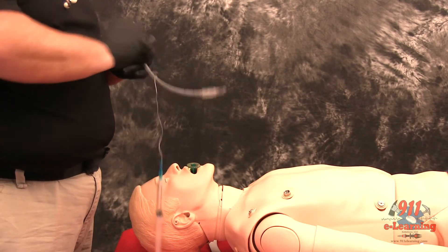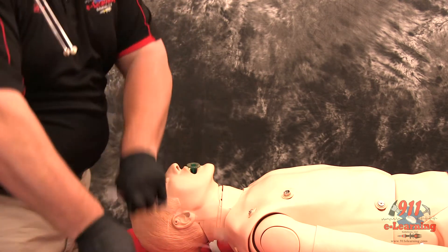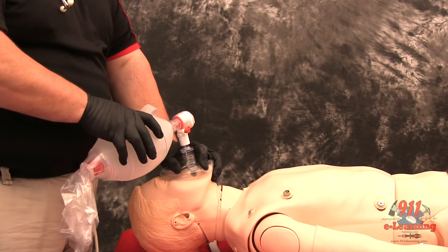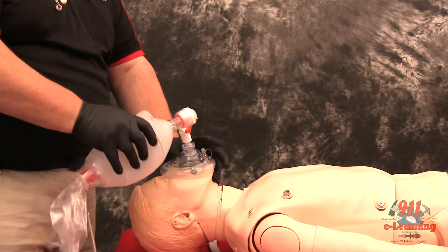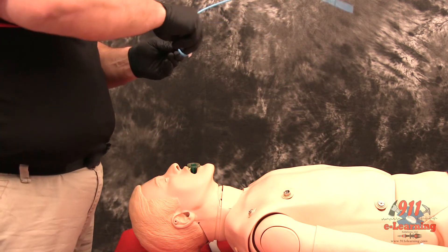Lubricate the distal end and cuff of the endotracheal tube and the distal one-half of the endotracheal tube introducer, or bougie. Failure to lubricate the bougie and the ETT may result in being unable to pass the ETT.